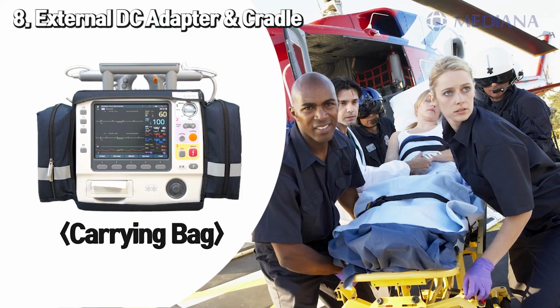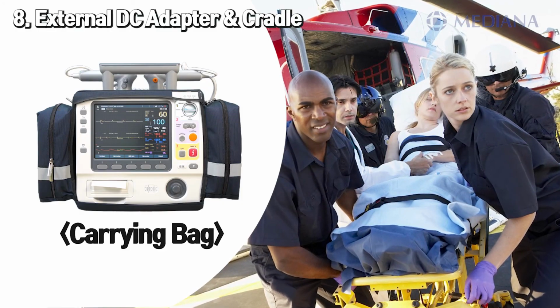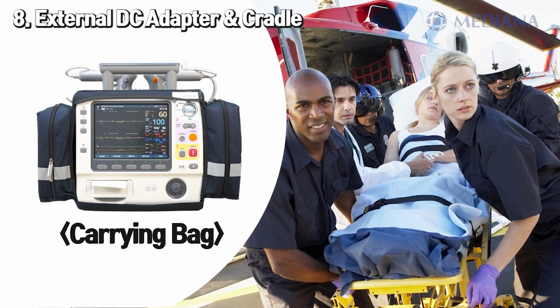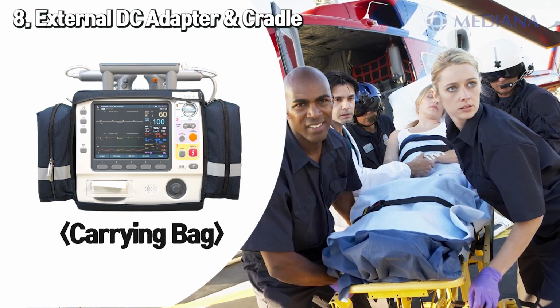Attaching the carrying bag for D700 makes transportation more convenient, especially for emergency medical technicians. Also, it can be attached to the external cradle without having to separate it, which saves time when recharging.